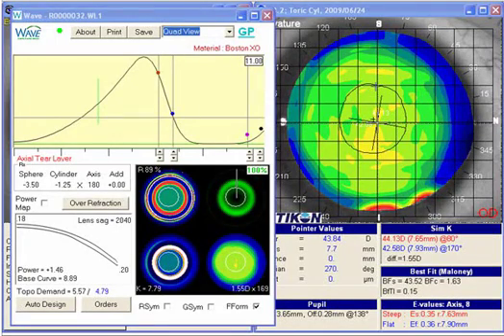Along the vertical, because the cornea has another diopter and 1/4 of cylinder, that cylinder won't be fully treated by having the power of +1.46. So what we're going to want here is an additional 1¼ diopters of power in that meridian. So we'll want to get the lens power up to about a +2.70 in the vertical meridian.